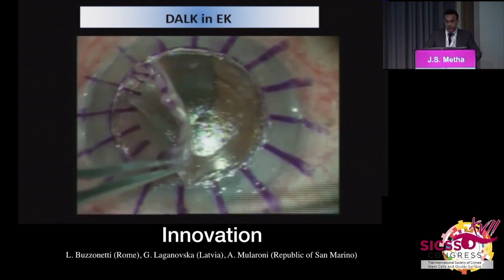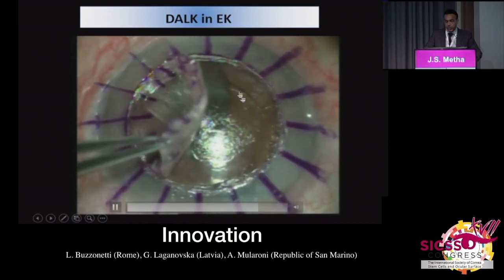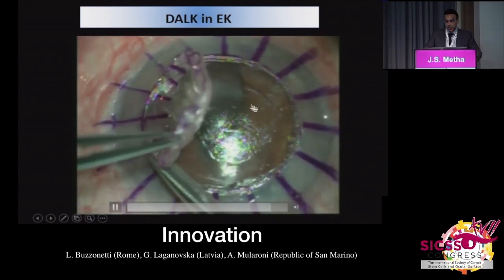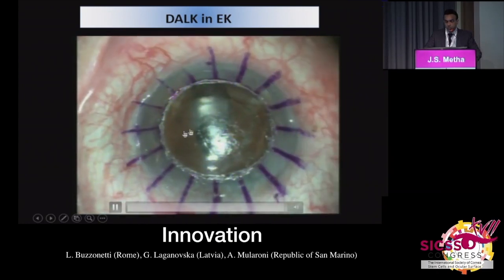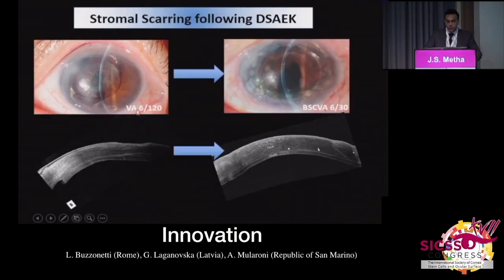Interestingly, often you'll see the area around the edge here where you can split the Descemet's membrane into two, and this is the area in the middle where the previous stripping has occurred when the previous surgeon did his DSEK surgery. Once you've pulled off the area, you put a full thickness donor tissue onto the surface. So this is what she looked like pre-op, and this is what she looked like post-op, and obviously there was some good improvement with the visual acuity as we regularized the surface.